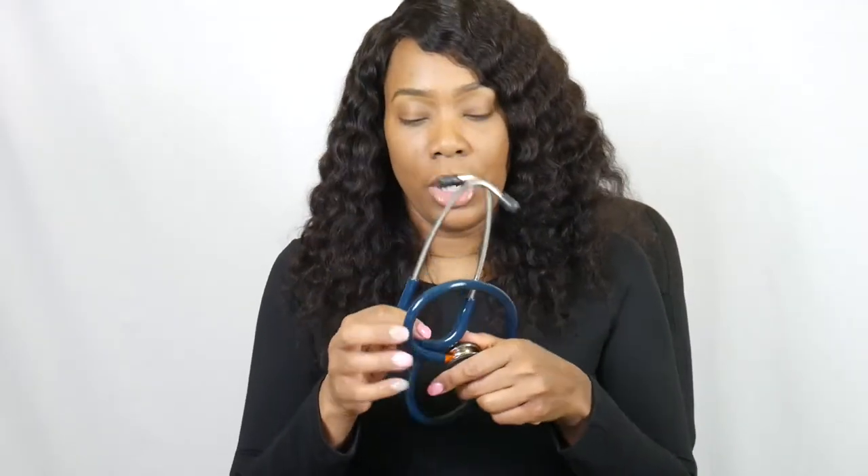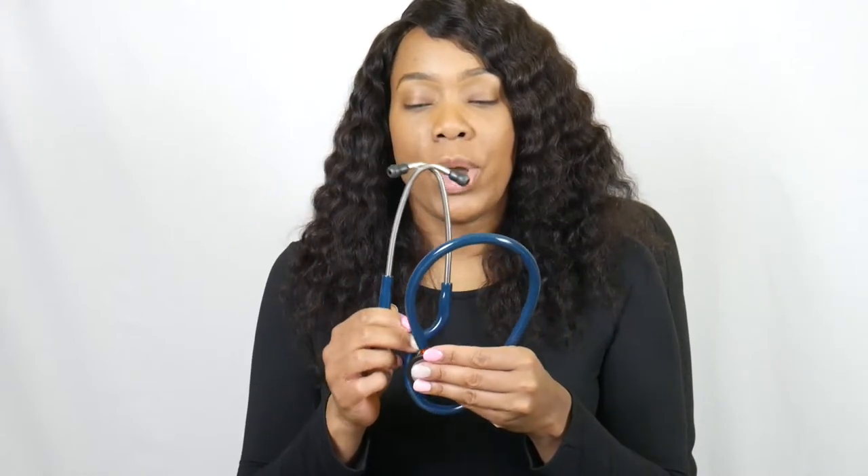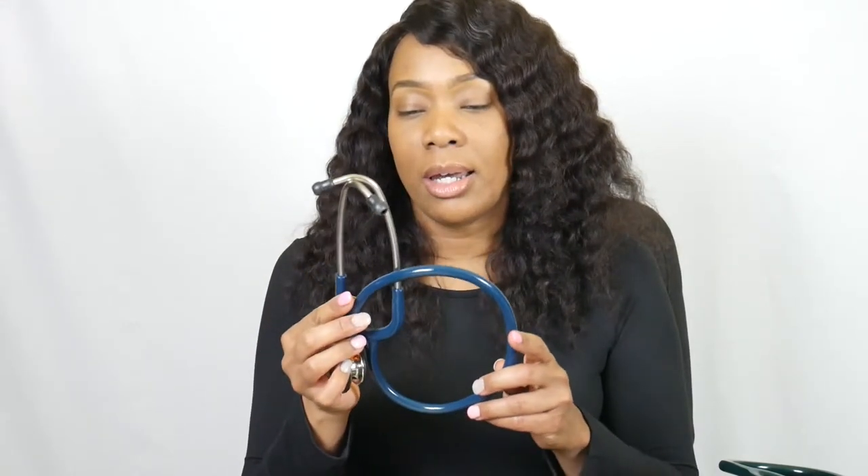With the Classic 3, you want to keep in mind it's a little more pressure sensitive, possibly because the Cardiology 4's bell is heavier. You have to apply just a little more pressure with the Classic 3, and that can affect the sound quality. So just keep that in mind.